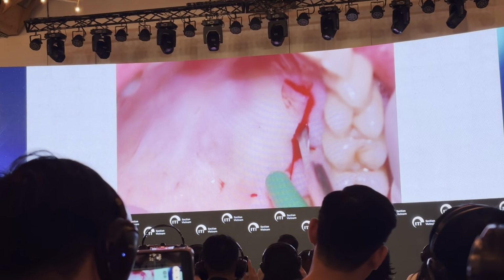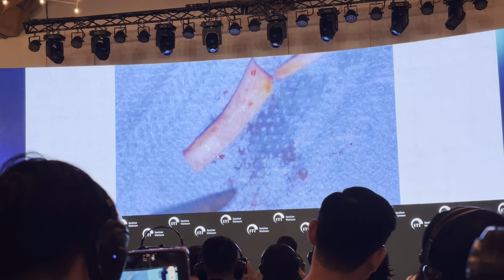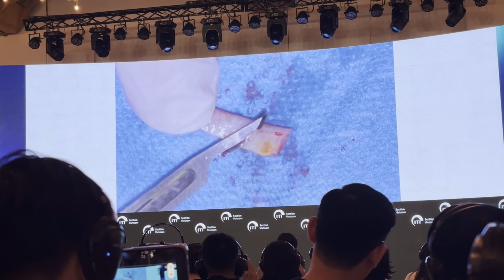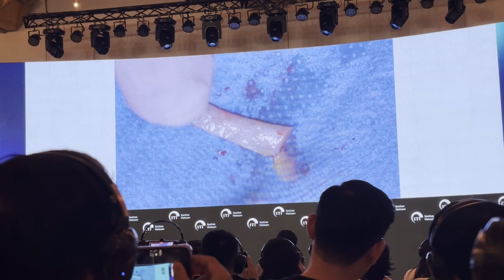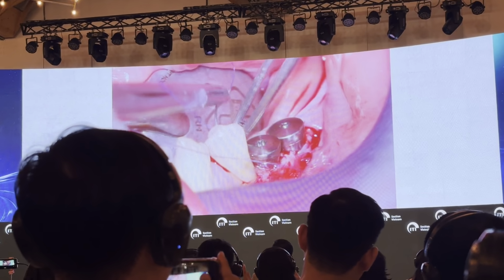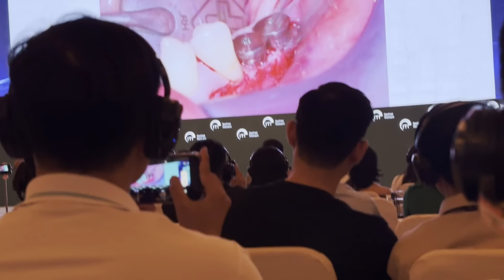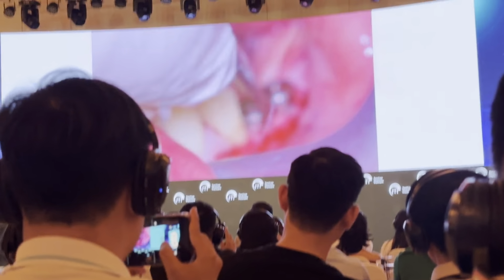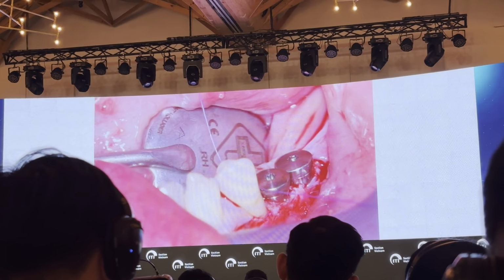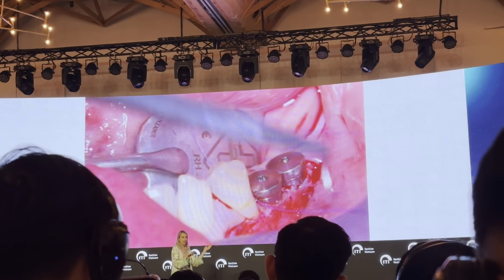also to the level of the premolar. So you see the long graft, which is not going to be de-epithelialized, but if we have glandular tissue in the inner aspect, we remove it, and then we start with the fixation. Remember, the tissue that was verticalized on the occlusal aspect to maintain the keratinized tissue on the lingual side.